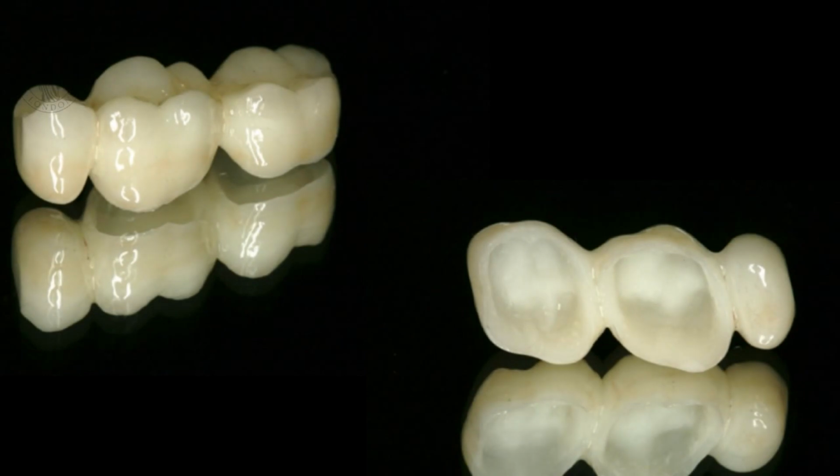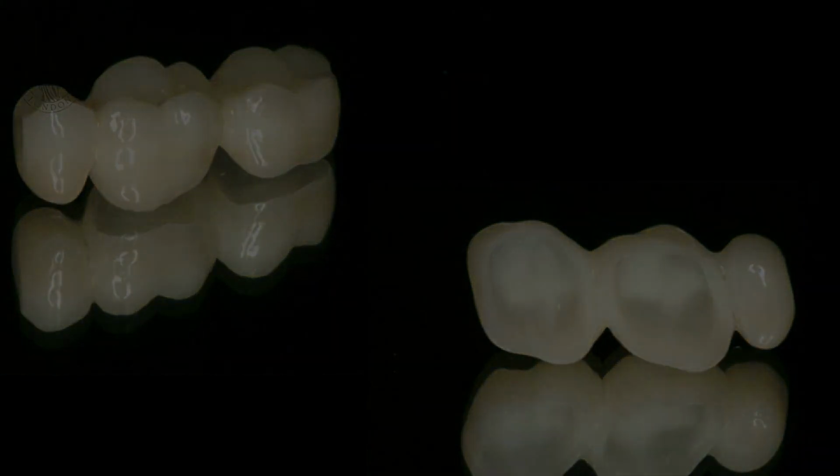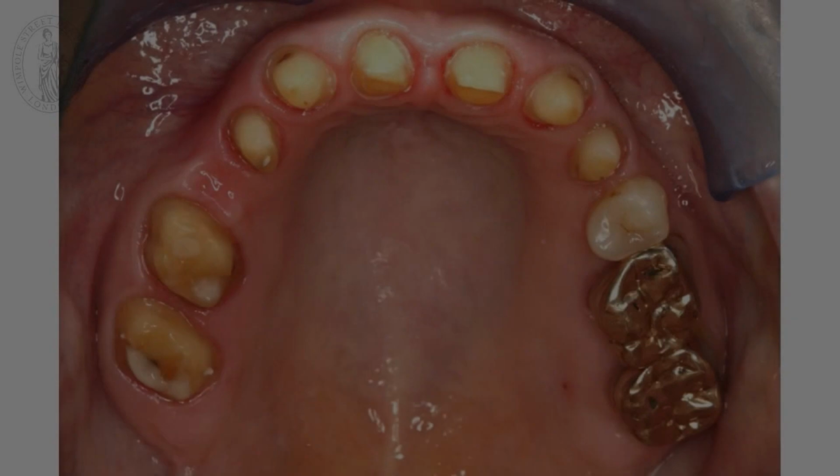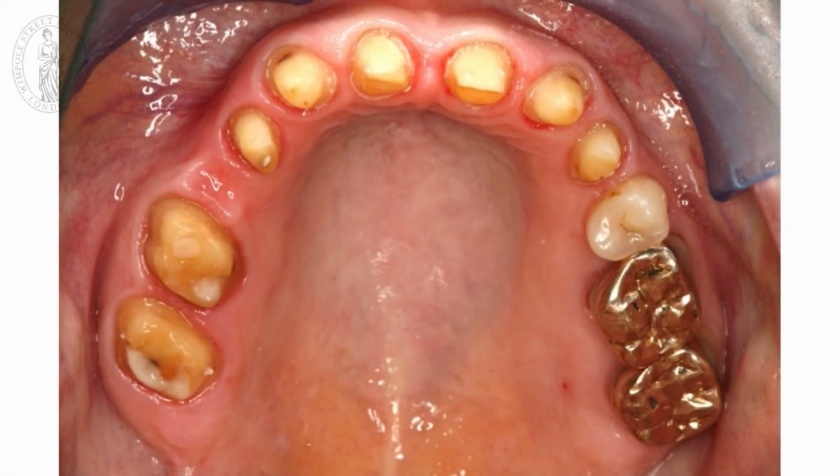You can see the full ceramic bridges. You can see the absence of a metal framework, and then single full ceramic crowns in the front as well. And then you can see the situation here is absolutely perfect. Gums are healthy, no decay, and the patient just wanted to leave the crowns in the upper jaw left. That means here on the picture on the right side.